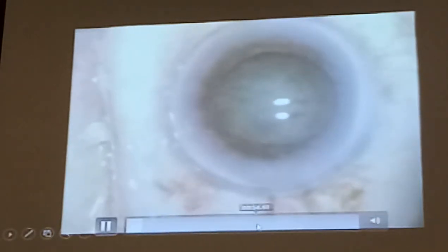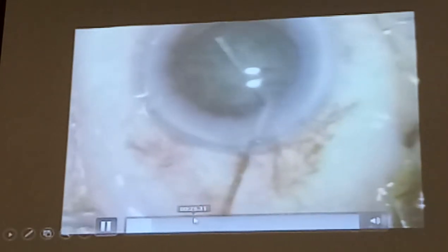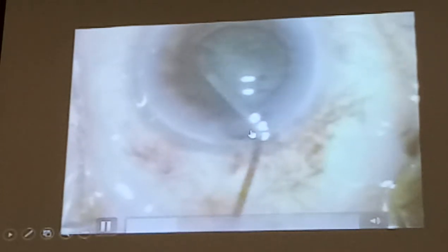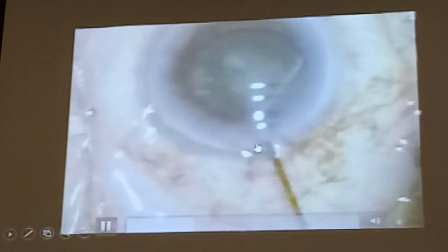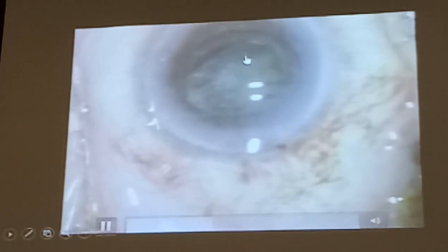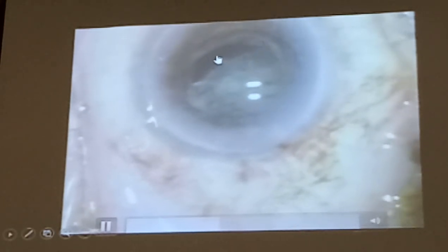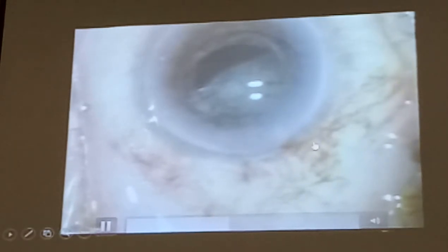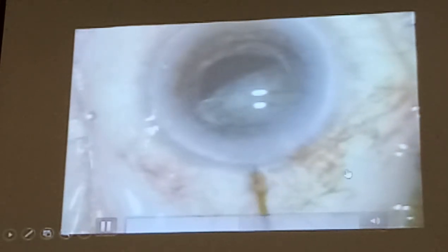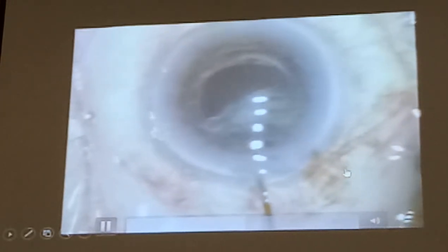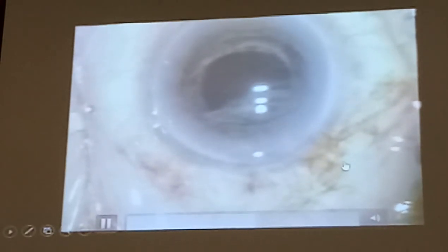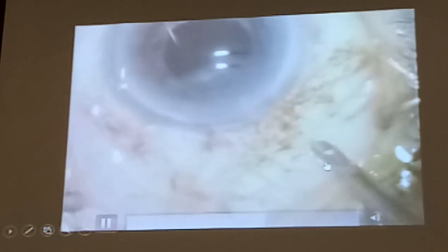This case — I think this was the hydro-dissection rupture. So this is the posterior capsule step sign you saw. Second time because my trainee didn't believe it. Trying to see whether it rocks — yes, it rocks. And then it starts to tilt — you can see the equator, and everything starts to sink. The whole nucleus is going down. And then the suggestion was maybe let's try and push it down with more viscoelastic. But that's not the right thing.